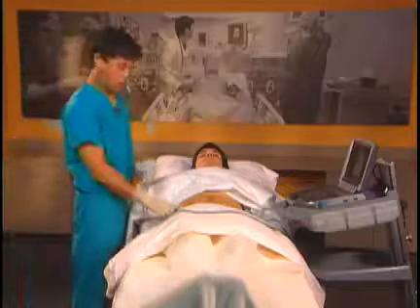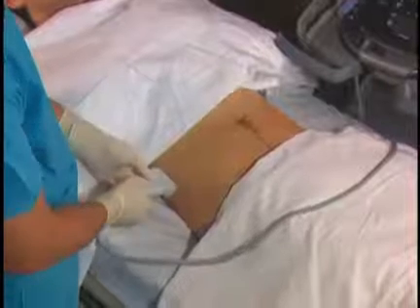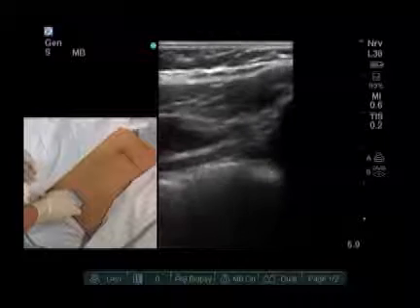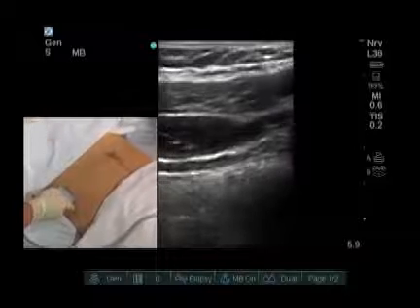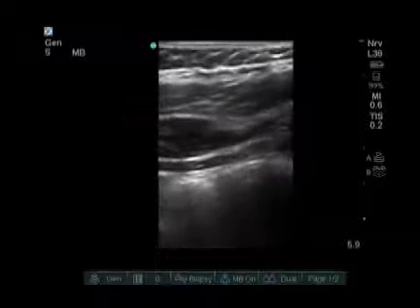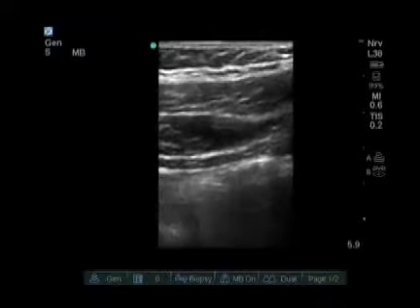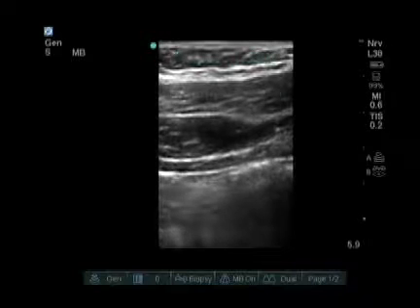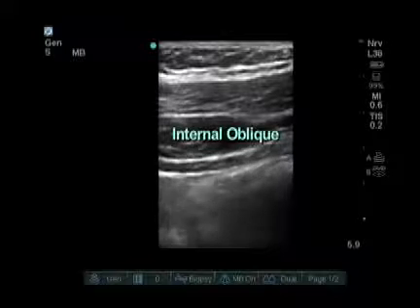Our initial probe placement is going to be just above the iliac crest. I usually place the probe in this direction so we can see both the iliac crest caudally and, if I move slightly cranially, you can see the three muscles of the abdominal wall. Going from superior to inferior: the first layer is adipose tissue, the second is external oblique, and the third is internal oblique.